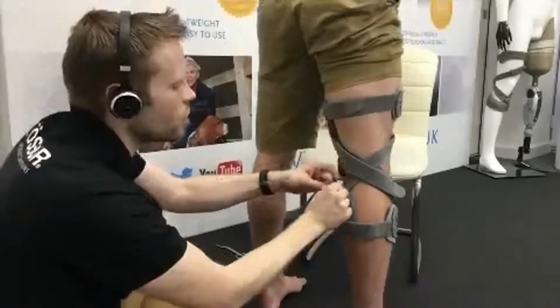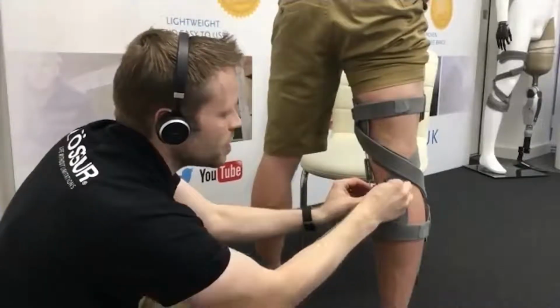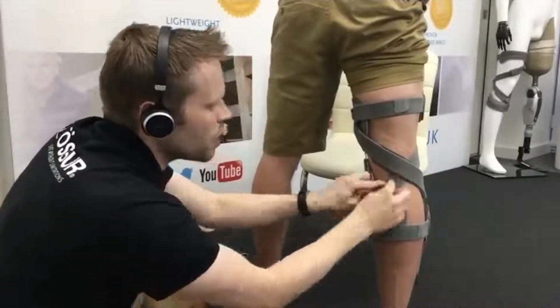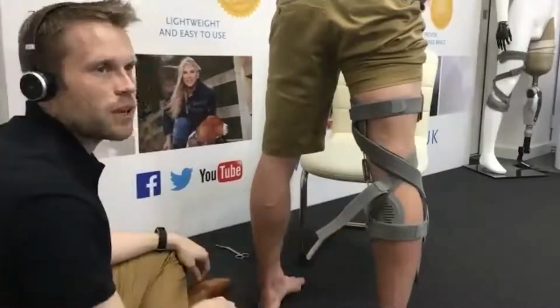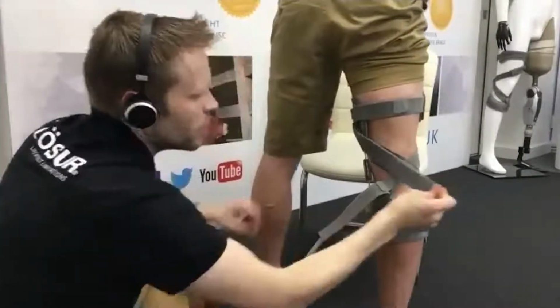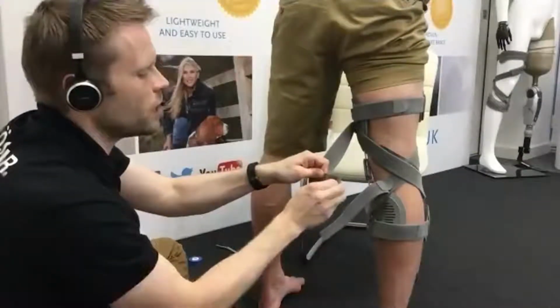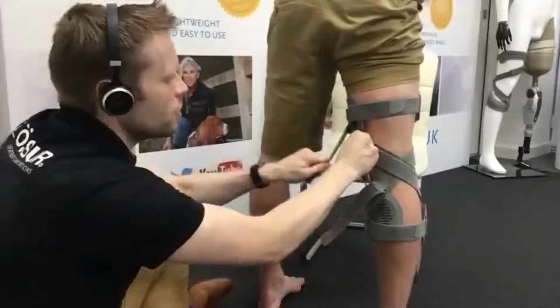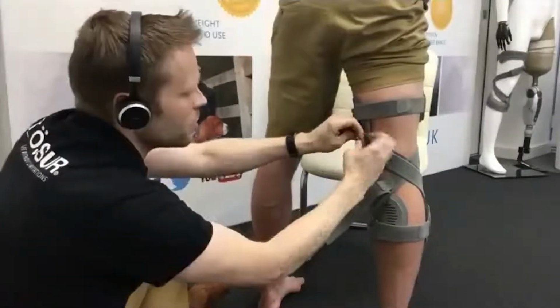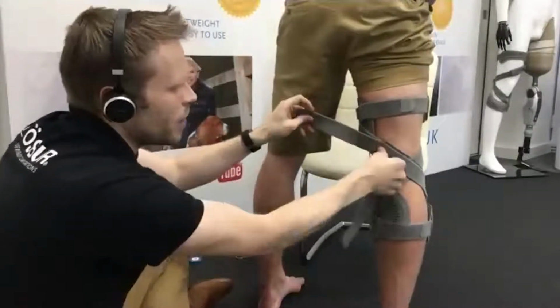So if you're concerned about trimming them, what's important is that you use these crocodile Velcro sections. I can actually just fold this over, fasten that into position, but you can see we've brought it back way out of the popliteal region. We'd actually perhaps go a little bit shorter on that one, but we'll adjust this one. And at this stage, we've got these sitting flush on the skin in position, and we've normally got a 5 to 6 centimeter gap or excess of strap.